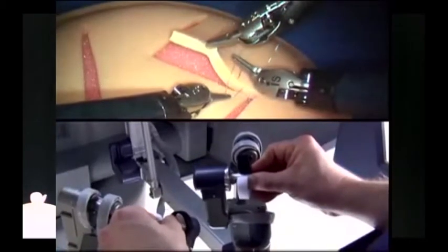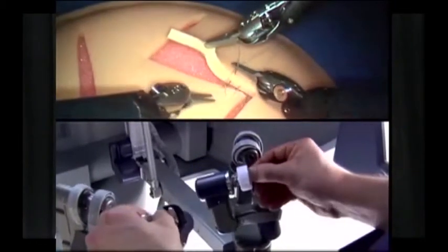As I mentioned earlier, we are working in a deep dark hole where magnification is more than welcome, and light. That's the biggest advantage. So how is the light problem sorted out? We are using a lens which has fibers in it, which carry the light down to the bottom of the lens, and that gives a very good clear picture. Plus it's magnified.